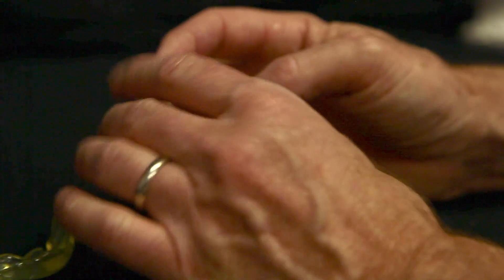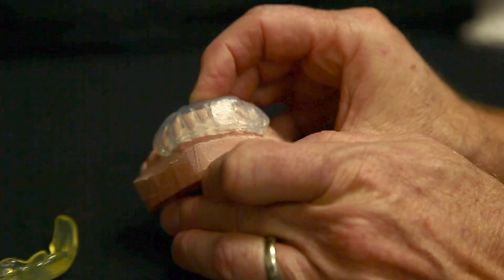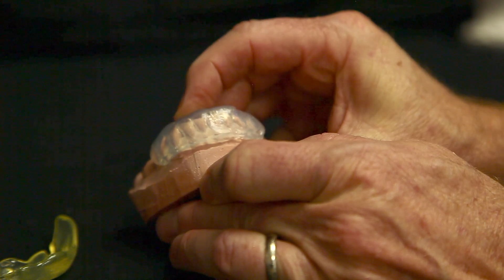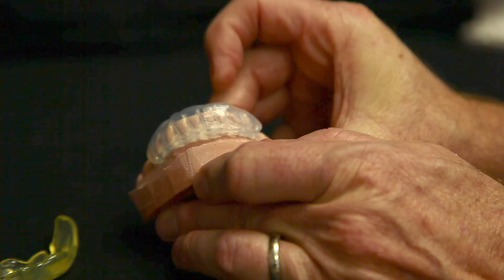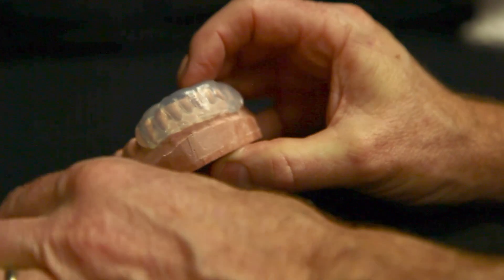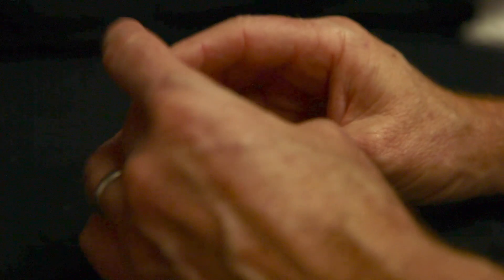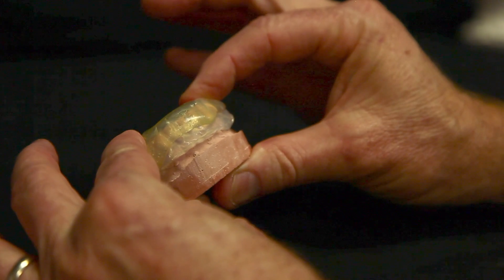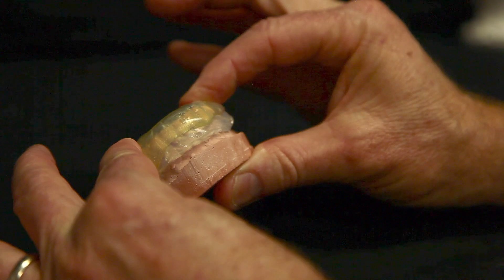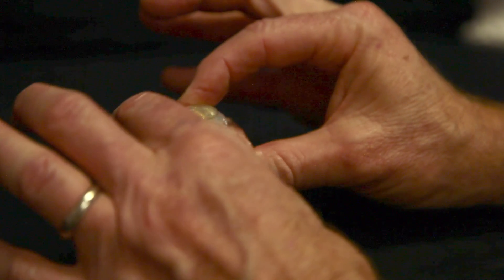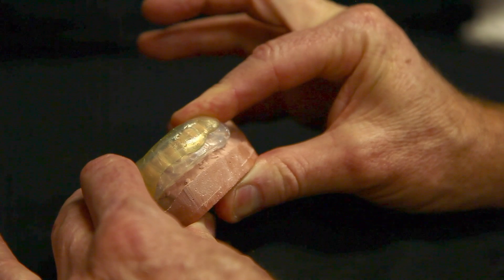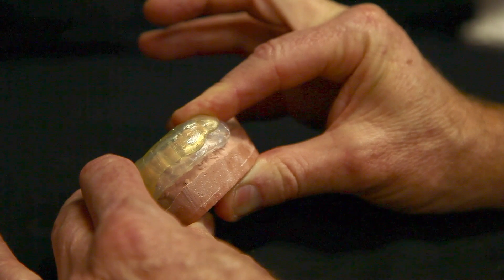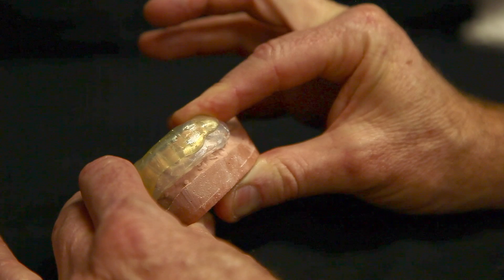So as you can see, without that, I can really distort these anteriors by overseating the tray. Now, if you place this and hold where there's no distortion, it'll completely and evenly distribute your forces and won't overseat your matrix and distort your composite addition.